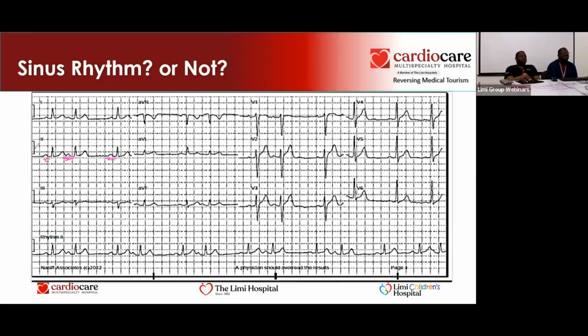Okay, then we come to AVR. In AVR, we now look at the P wave there. The P wave is not very clear here. There's a P wave here. Fine. Is it inverted? Yes.